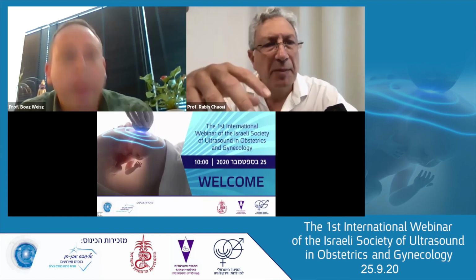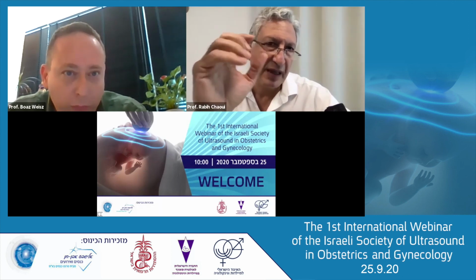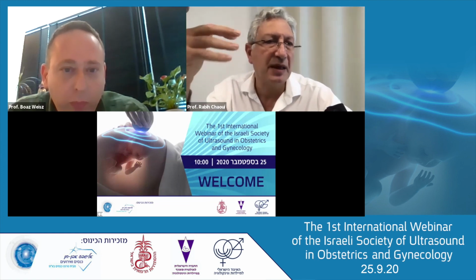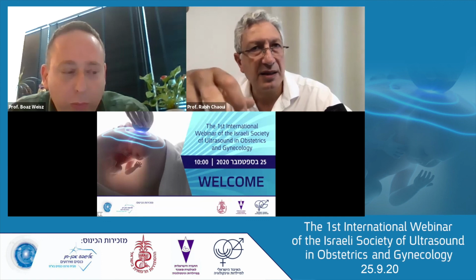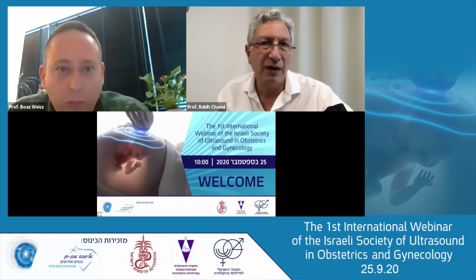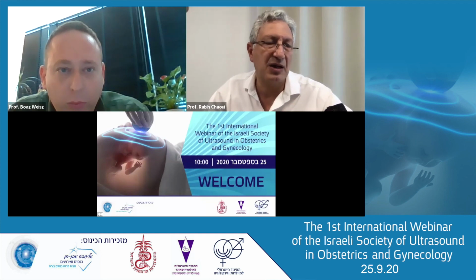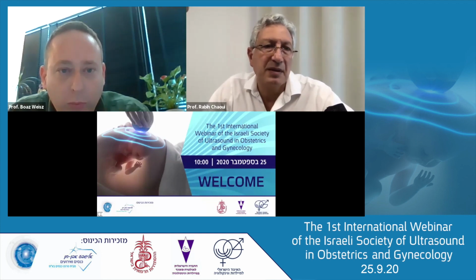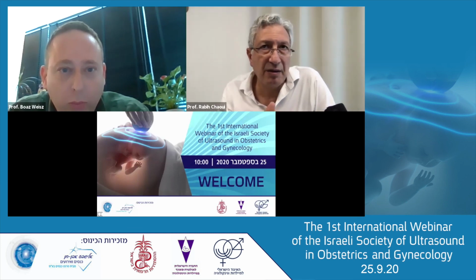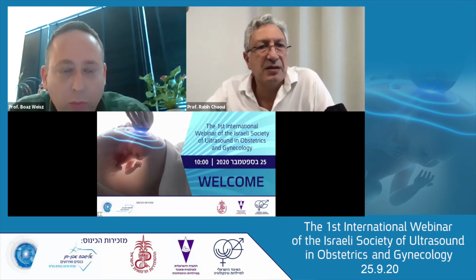You see a large azygos. I had a referral of a photo, because they have a high-resolution machine and they see it from the side. But if it's enlarged, it needs some blood coming in. We published a case where the ductus venosus entered the liver and went directly into the azygos vein. So you should seek downward which vein is entering the azygos and leads to its dilation. Sometimes in this case you have a normal size IVC. But sometimes, if a renal vein goes to the azygos, you may see a tiny inferior vena cava and an azygos.